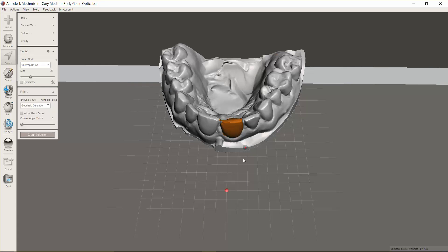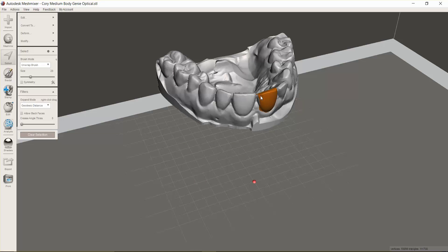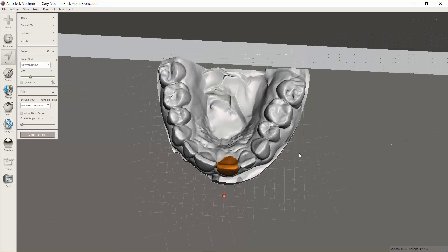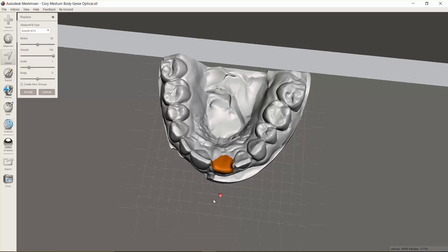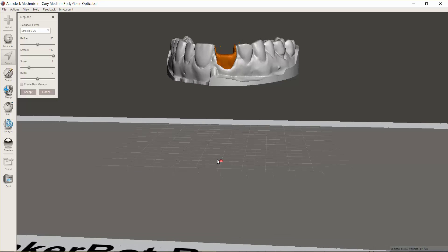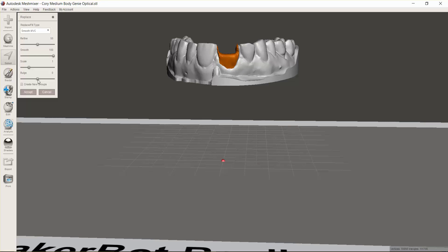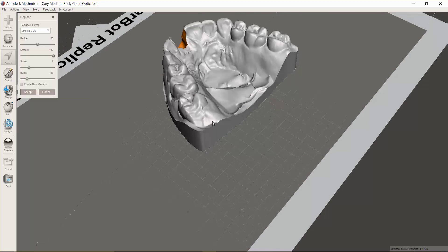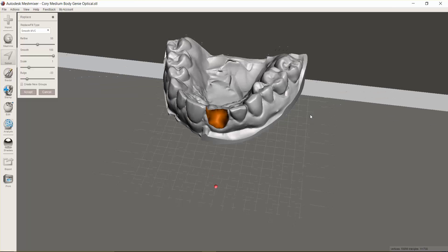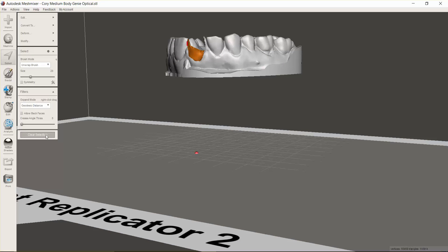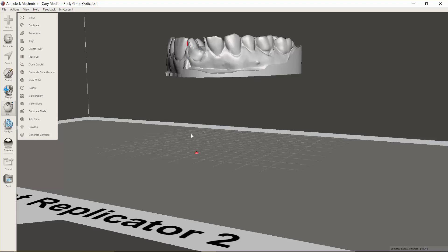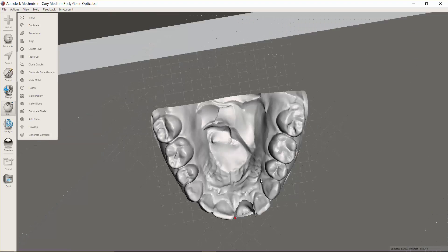We've got that entire tooth selected. Now we come to Edit and choose Erase and Fill — as you can see, it's erased the tooth. But what we'd like to do is actually create a little ovate, so if we come down to Bulge, we can drag that downward and now you see we've got a very nice ovate pontic site. Click Accept and now you've modified your STL to have an ovate pontic site.